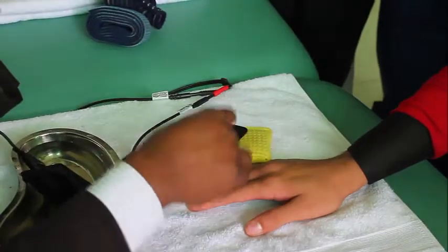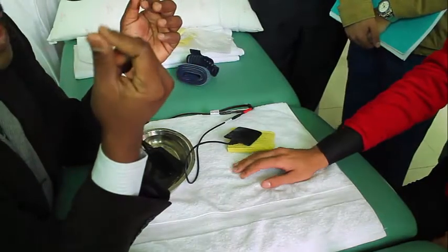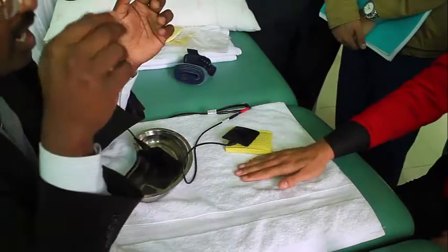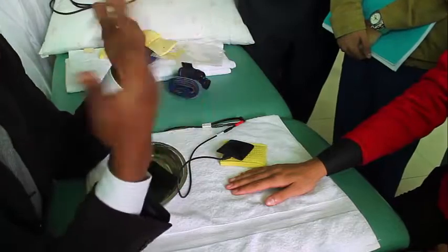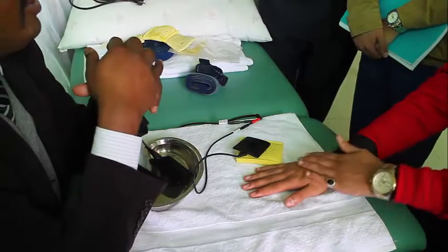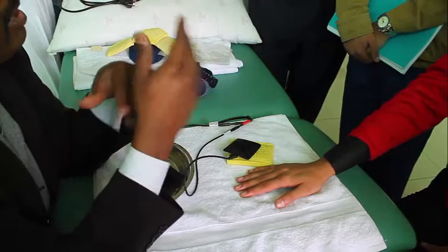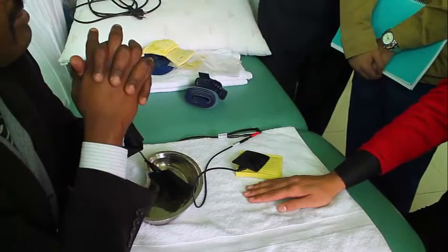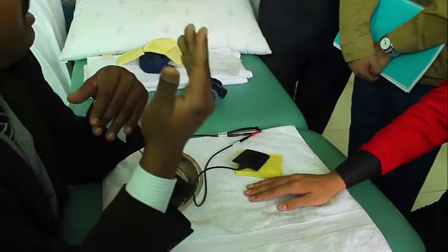Third, sometimes some people will have more hair. So much hair will be there. As you know, hair is an insulator. You cannot conduct the electrical current very easily. And if you want to stimulate that muscle for more time, like 6 weeks, 10 weeks, every time the hair will be a problem for the electrode. So at that time, you have to shave the area, whichever area you are applying the electrical current. So shave the area of skin, then you can apply.